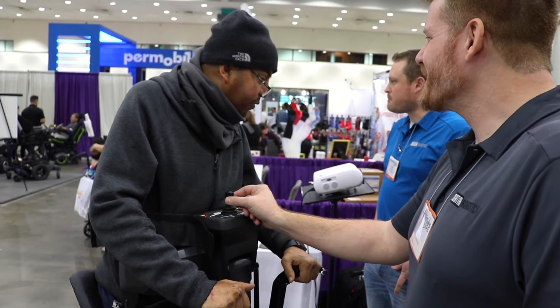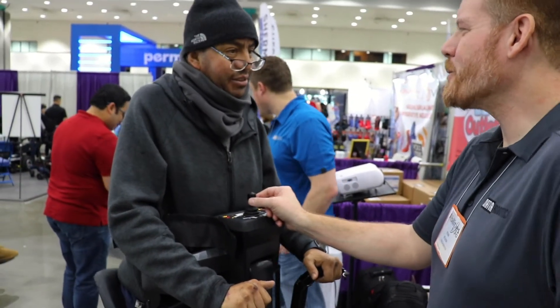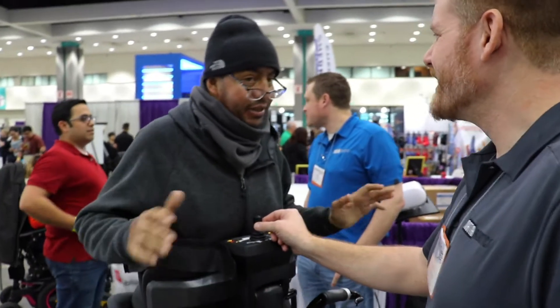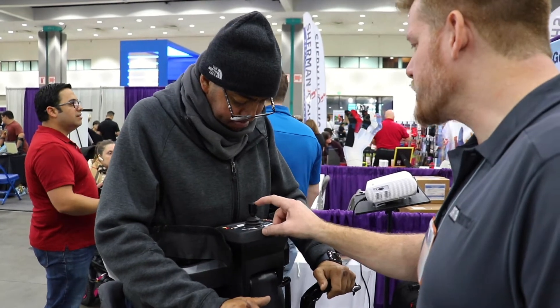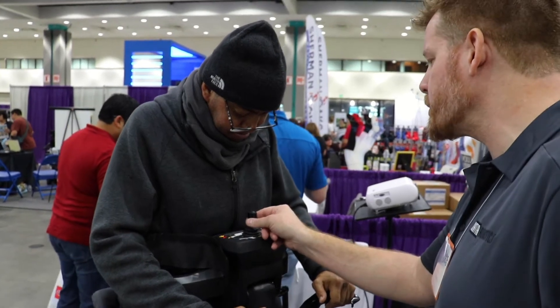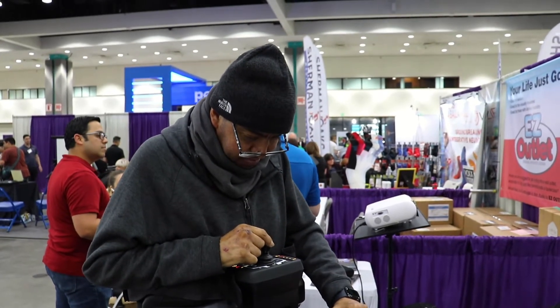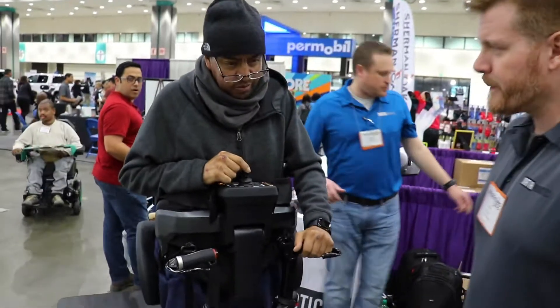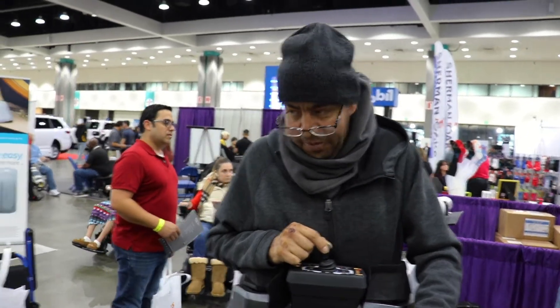I'm just going to go forward a little bit and back. Go for it. We're built to stand — I mean, we're built to stand. This guy here, this is your joystick. This is a proportional joystick just like your other chair. Little push, little go. Big push, big go. So, little movements, and then once you get the hang of things you can push it all the way and crank up the maximum speed. It's going to be easy, it's going to be gentle. Just go like this.